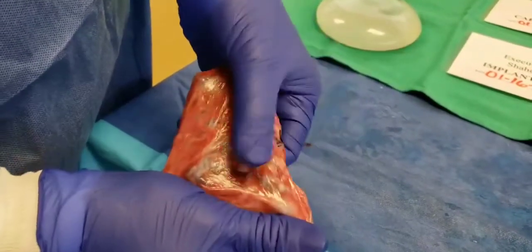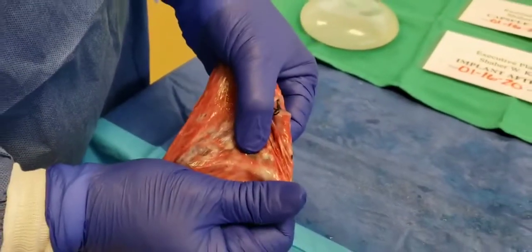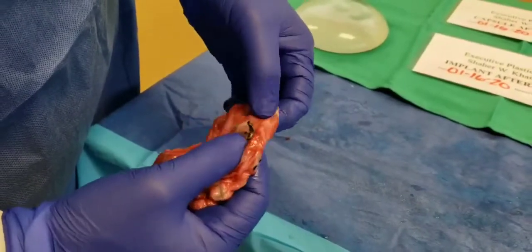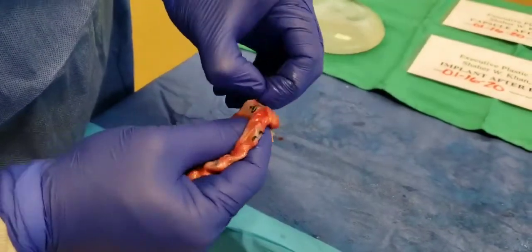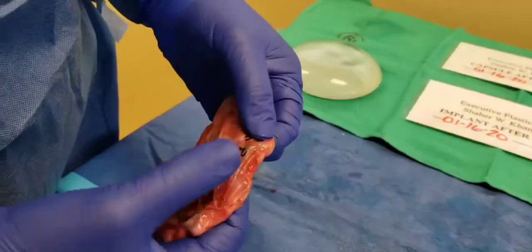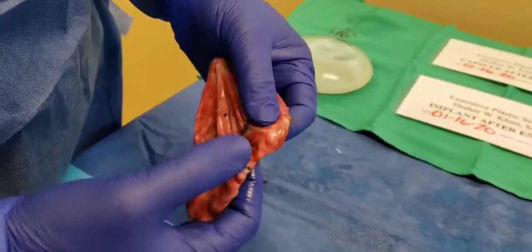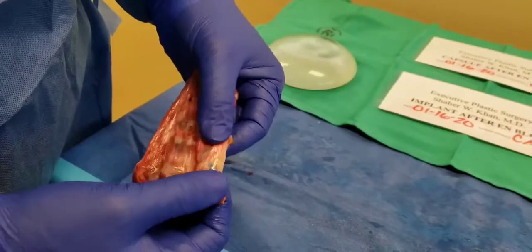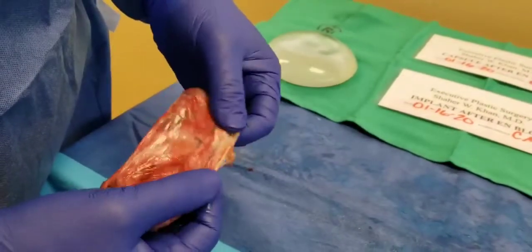This is the capsule. As you can see, there's some areas that are transparent and areas that are very thick. But as you will see, this is the suture material that I'm going to literally pull out, which is consistent with ethyl bond suture. Very thick, normally not used, but I found that this was pretty much all over the capsule.